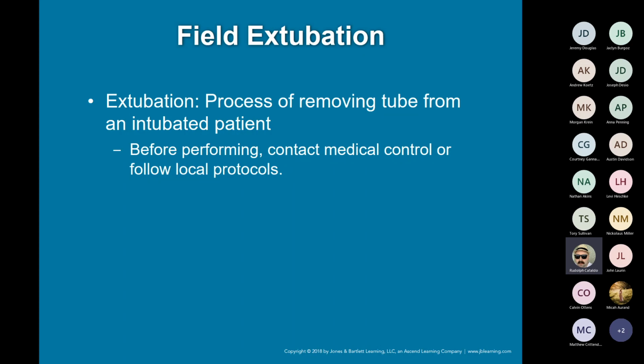And you guys get to be a part of these during your same day surgery and your pre-surgery clinicals. But extubation is nothing more than the opposite of intubation. With intubation, obviously, I'm inserting a tube. With extubation, I'm removing the tube from the patient. Again, I don't know of any protocols to say this, and before I did something, you're probably going to be consulting with a doc on the phone, telling them what's going on, and if they give you orders, that's a different story. But this isn't something we're doing on our own.